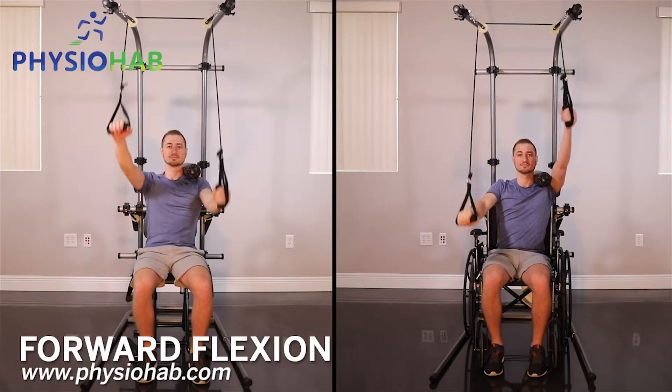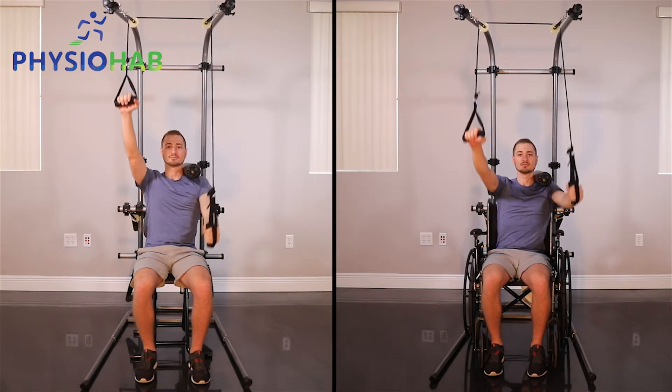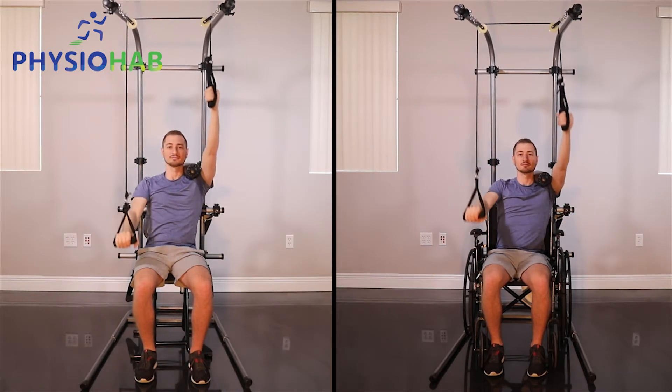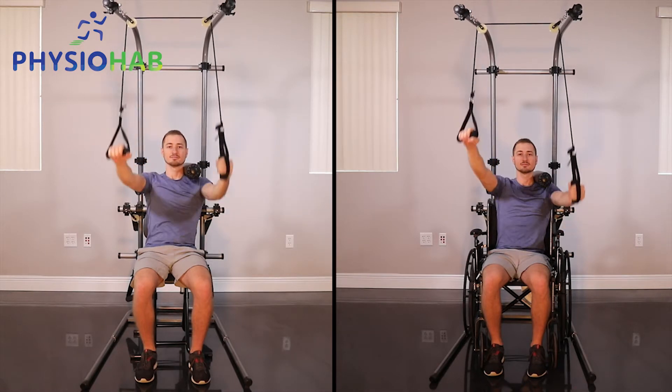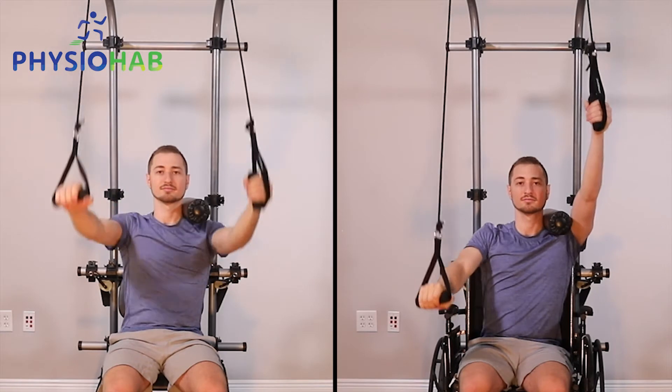This exercise is for shoulder flexion. You want to start with the affected arm hanging on the side with the pulley system, and the unaffected arm on the opposite side of the pulley. Once you pull down with the unaffected arm, the injured arm will start to raise slowly to patient tolerance.